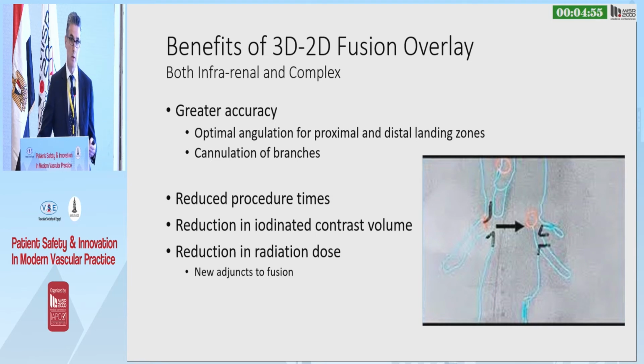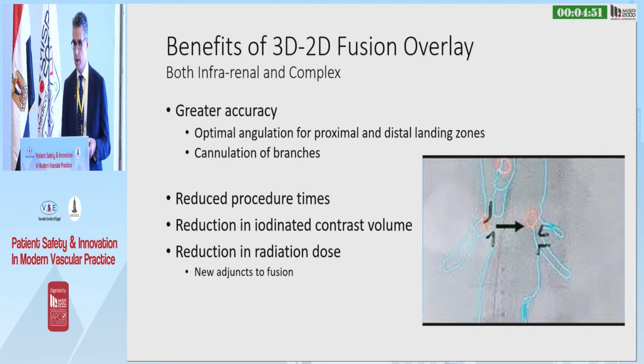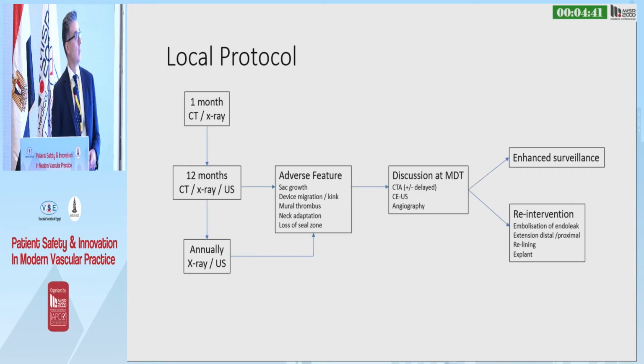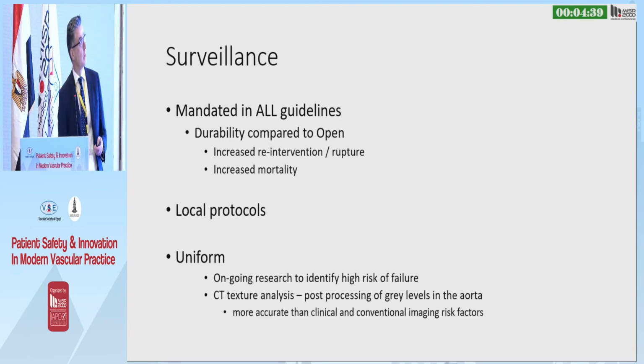There are also new adjuncts to fusion imaging. We've heard that people use IVUS, and there are some optical imaging techniques that are also beginning to come into use, and we'll hear about that tomorrow. Sorry, I might have jumped on there.